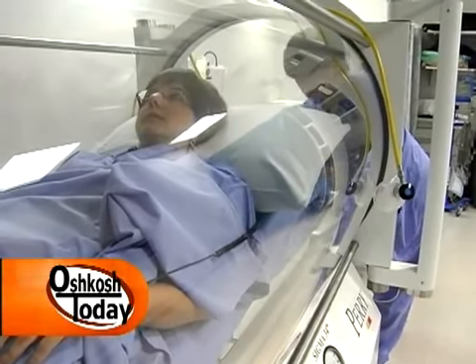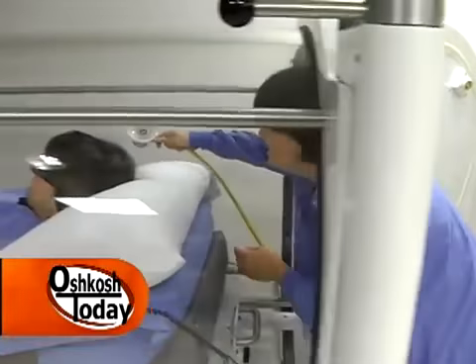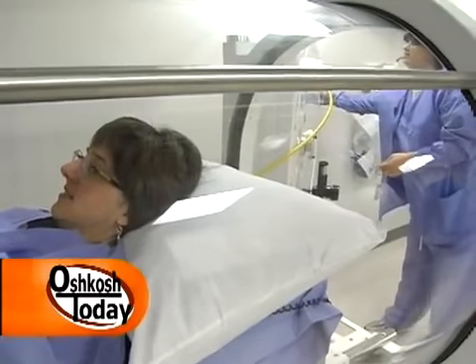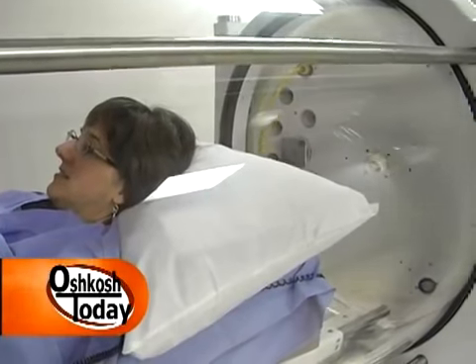Okay, now typically when I've heard of this, and I think when a lot of people think of a hyperbaric chamber or therapy like this, they think of divers and deep sea diving and getting the bends, but that's not always the case here. What type of person would need a unit like this? One of the indications is decompression sickness, but we don't see much of that. We don't have a deep diving place in the area, though there may be some people that would fly in from diving at the Caribbean or something. What we usually see is wounds that do not heal. People with vascular compromise like peripheral artery disease or diabetes, and the wounds get stalemated or stagnated and they don't heal well, and they do better with high pressure oxygen therapy.